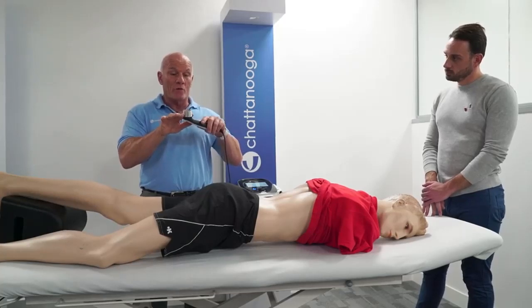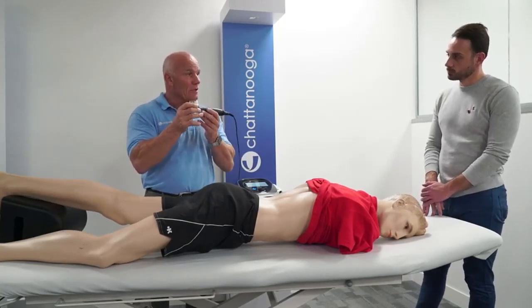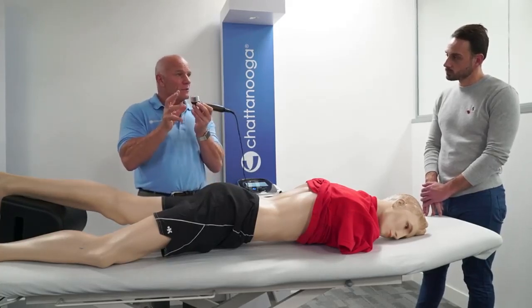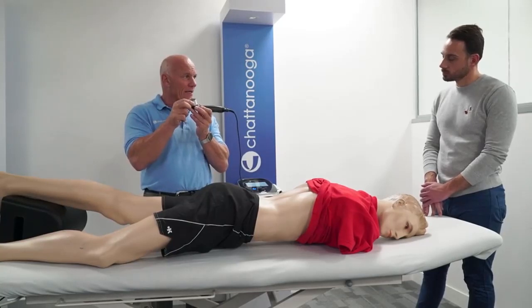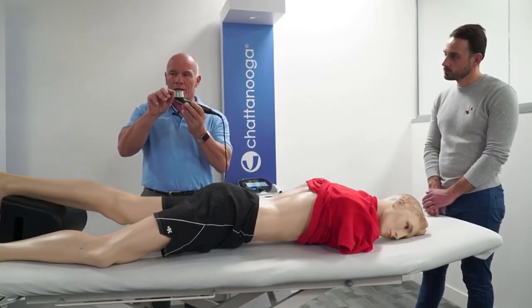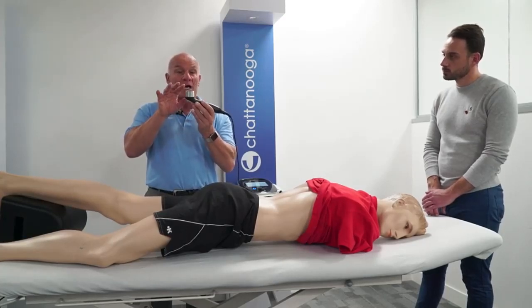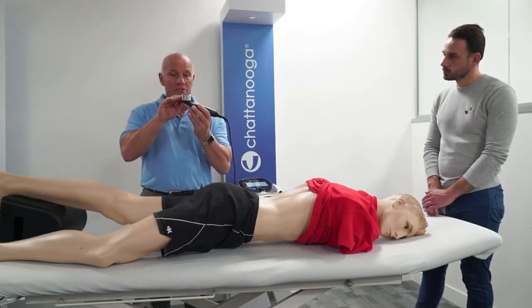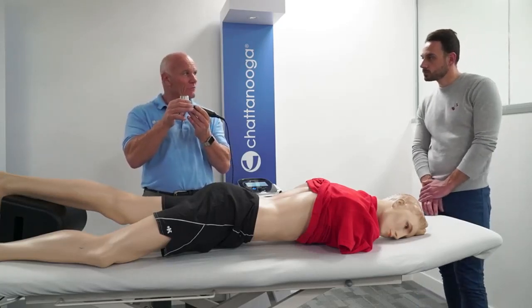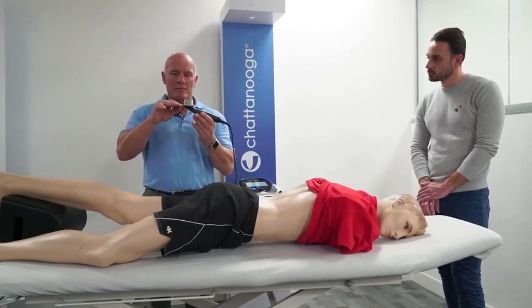Okay? But this is a man-made crystal. And even with the purest diamond, you're going to get little flaws in there. Okay? So 1-to-1 is ideal but impossible to achieve. An 8-to-1 ratio is considered not acceptable in the medical regulations. And the industry standard now currently lies between 5-to-1 and 6-to-1 ratio.